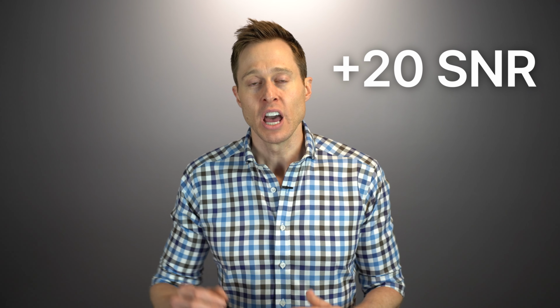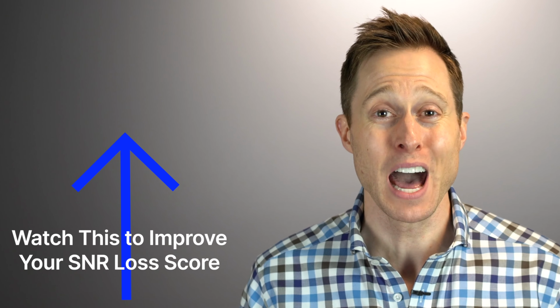But you do have to remember that this all depends on how big your signal-to-noise ratio loss score is. If you have an SNR loss score of 20 decibels, and you improve that by 10 decibels, you still need the person talking to you in a noisy situation to be twice as loud as that background noise, and that probably ain't gonna happen. Nevertheless, if your goal is to hear better in a background noise situation, it is highly recommended that you get hearing aids that have really good directional microphones, and you have a hearing care professional who takes the time to set those directional microphones up correctly. And if that isn't enough, you're gonna have to use an assistive listening device to improve that score even more, but that is a topic for a different video.